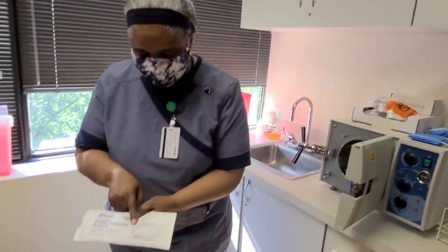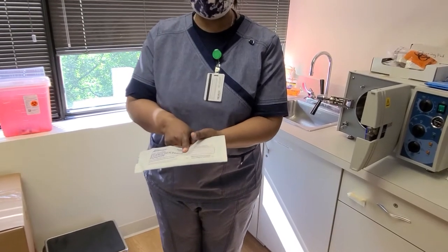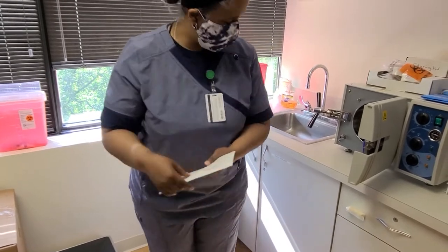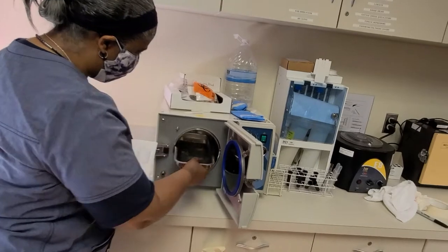And as you can see, it's pink. I should have a sterilization indicator strip in here. And what is my shelf life for this one? 6 months. 6 months minus 1 day. Right. So the first thing I'm going to do is I just want to check this.